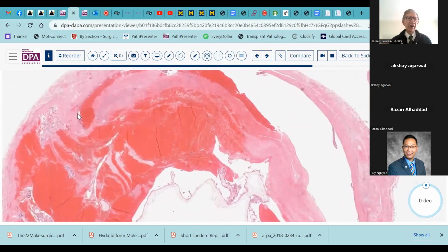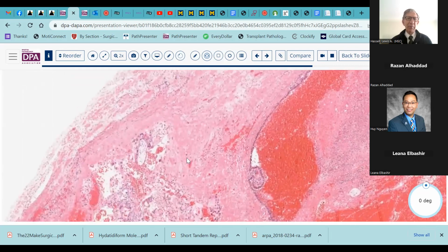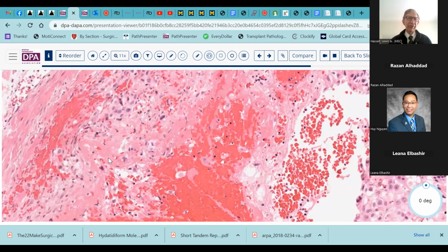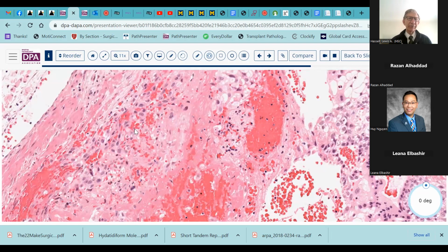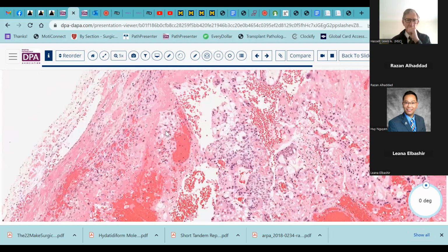Now, we don't see a lot here in terms of gestational reaction, but sometimes that may be all that you see in the fallopian tube as an indication, particularly if it's ruptured out into the lumen. So being aware of deciduoid changes like these plump cells here can also give you a clue when you don't have truly diagnostic villi.